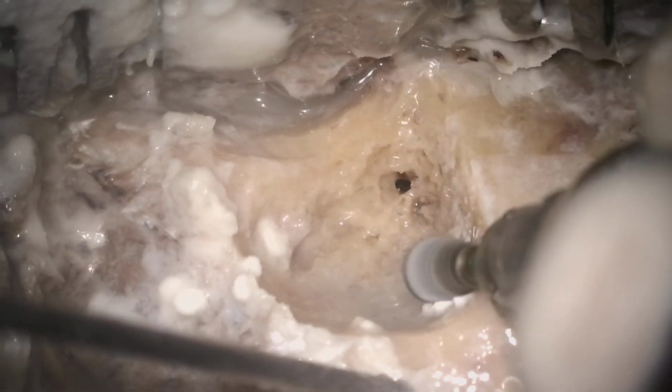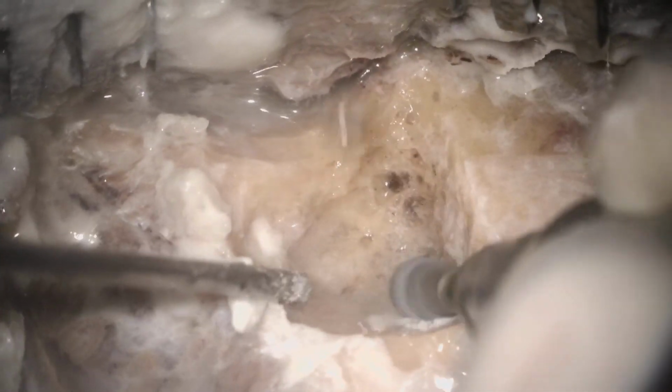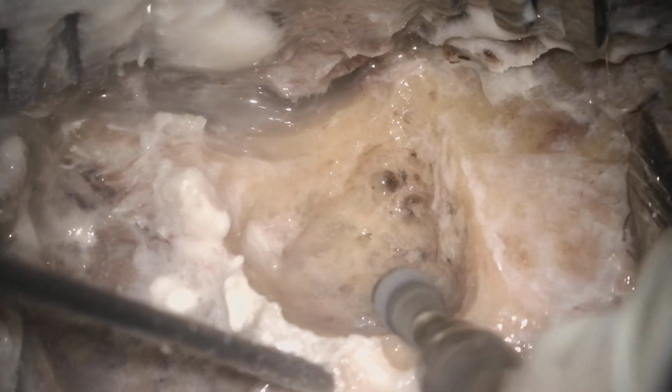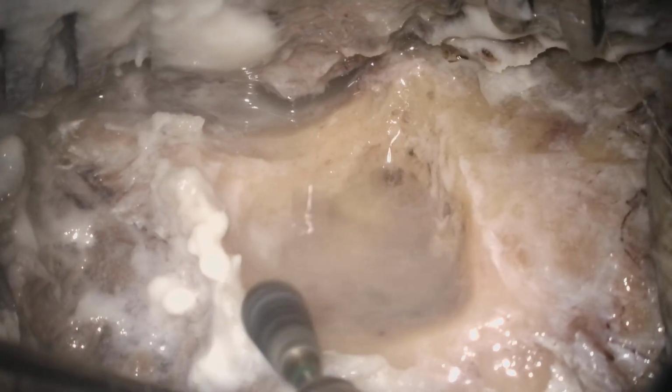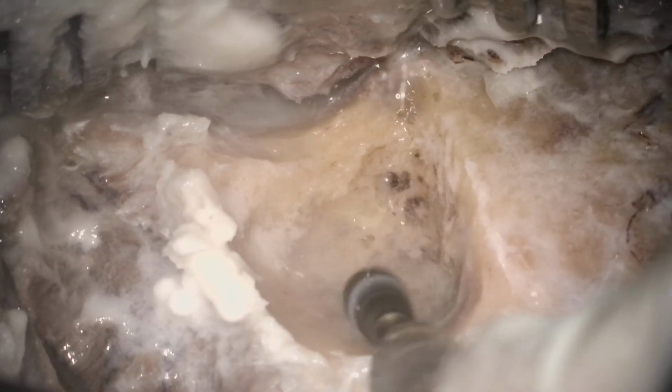Okay. The second is the color change. In temporal bone dissection, in the dead body or cadaver dissection, this color change sometimes doesn't help you, because there is no actual blood flow that gives the color. But in live surgery like cortical mastoidectomy or canal wall up or canal wall down mastoidectomy, you will always have this color change very beautifully.